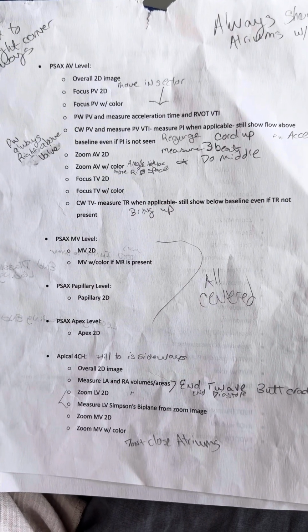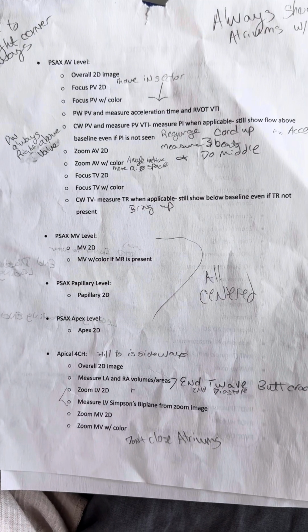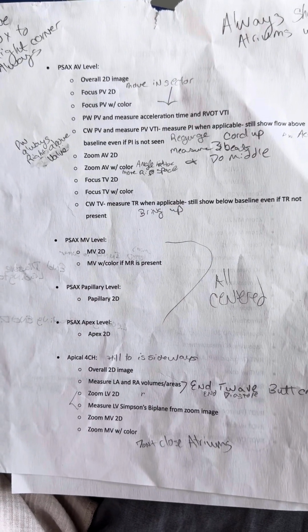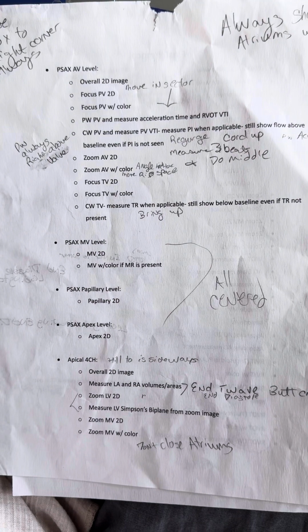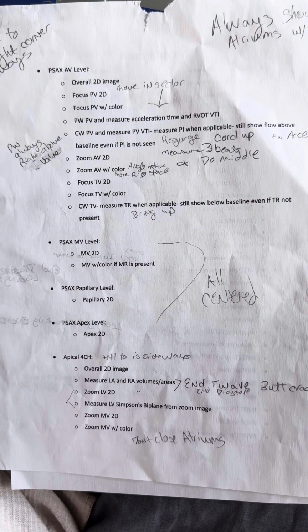Now we go to 4-chamber. Get your overall 2D. You're going to measure your left atrium volume and your right atrium area. This is end diastole.